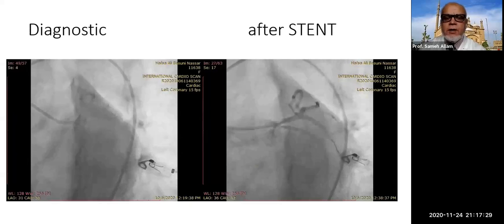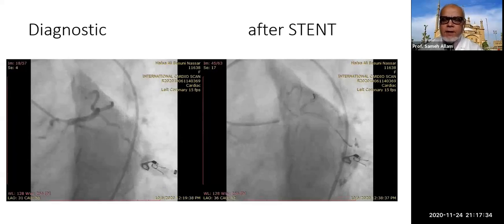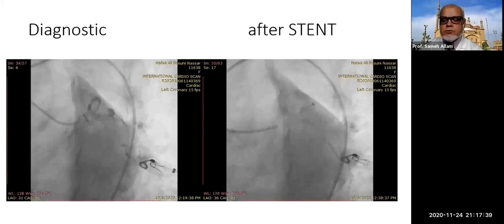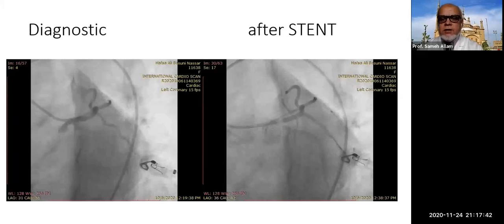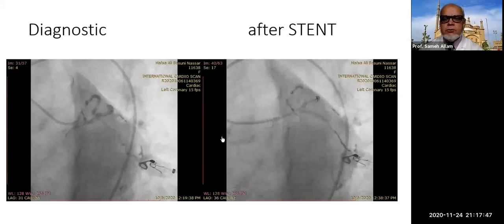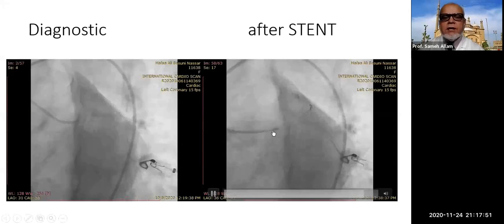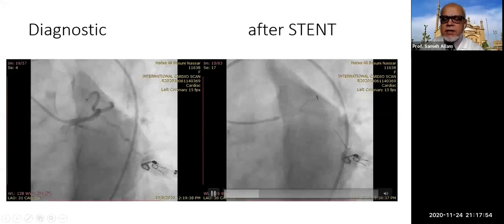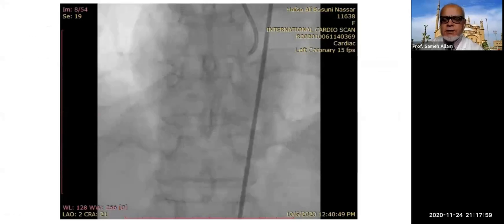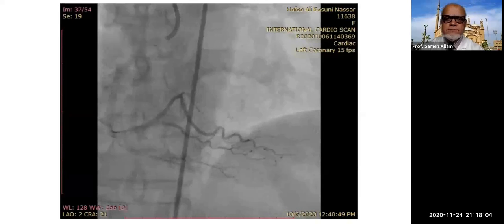It hits the roof, and this was the atheroma that was reported in the multi-slice, and they said that it is not causing significant obstruction. No significant narrowing of this segment was documented again by angio, but it was a vulnerable plaque. Once the catheter hits it, it ruptures, the plaque ruptures, and dissection occurs. We did not forget the RCA. The stent in the RCA is patent, and it's a large dominant vessel.